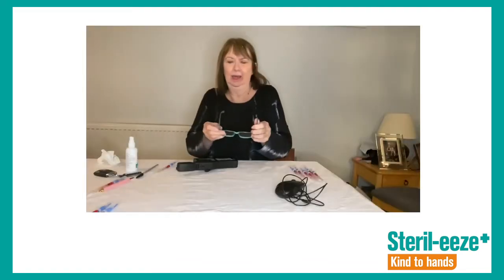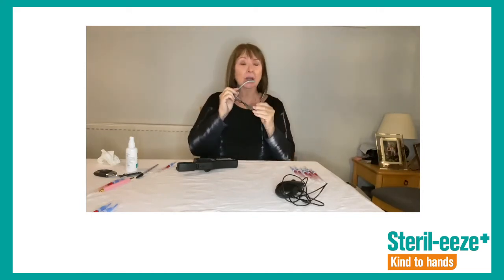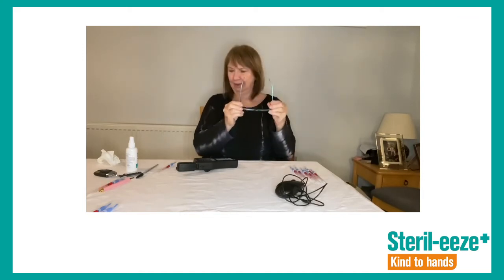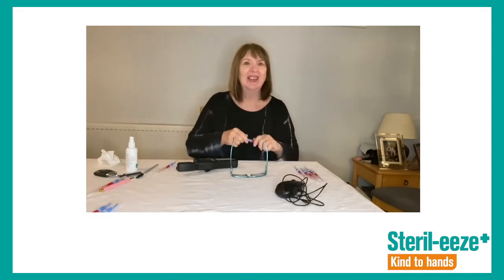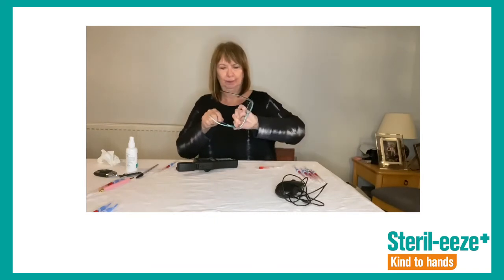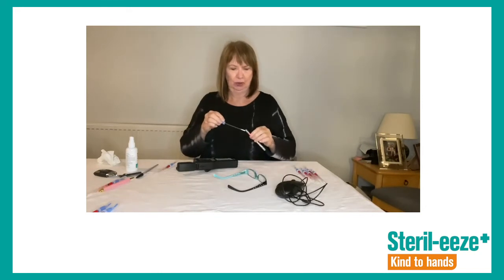So finally, I think we'll just look at one other thing, and I think we'll look at my specs. I'm dreadful for my specs on my hair. I often do this. As a microbiologist, you wouldn't think I would put things in my mouth, but here you go. So hopefully I'll have a nice contaminated set of specs. So let's just see how contaminated it is. So I'll swab the edge. I've had this in my mouth, if you remember. So swab the edge.